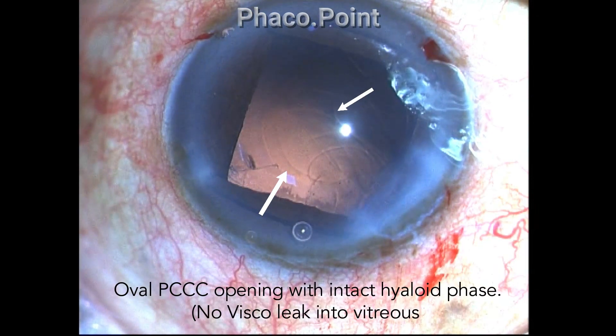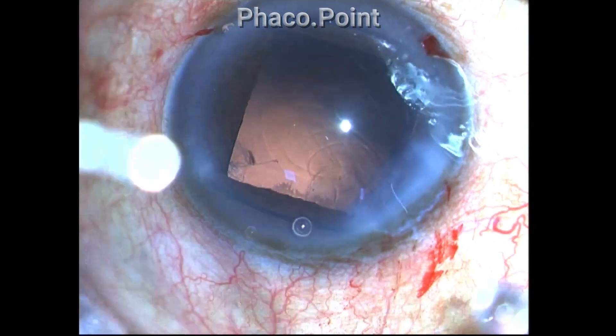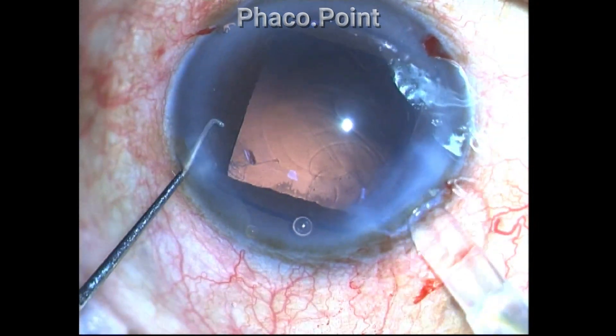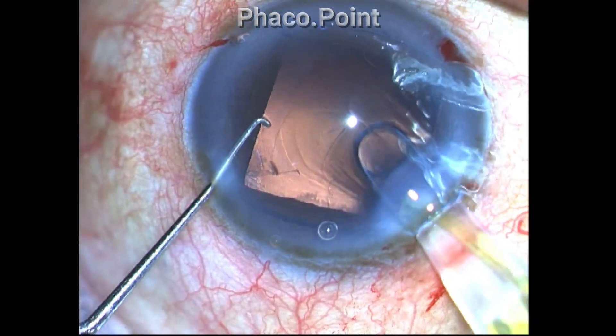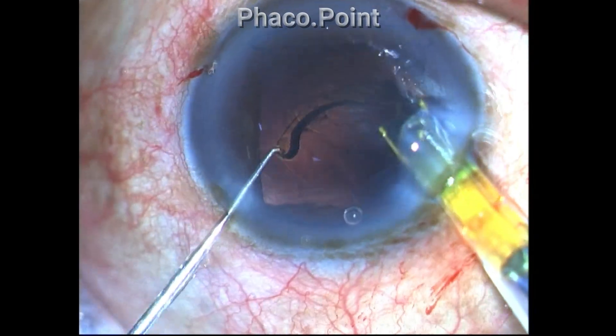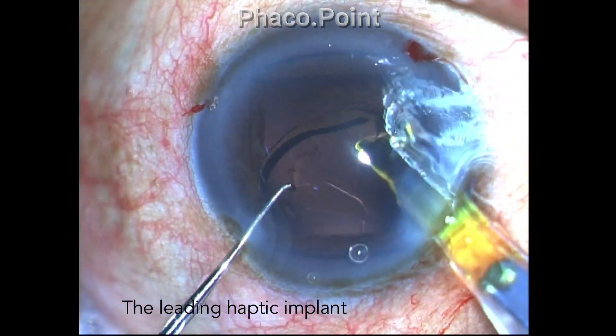You can see the smooth opening there. The hyaloid face is intact because the viscoelastic I am injecting is not oozing out into the vitreous, as can sometimes happen. I now go ahead to implant the hydrophobic acrylic lens.